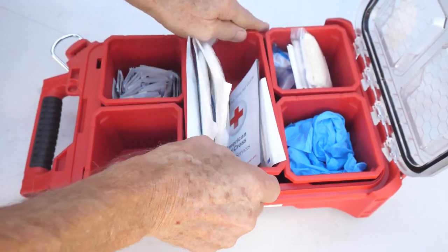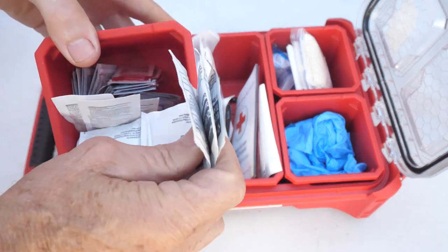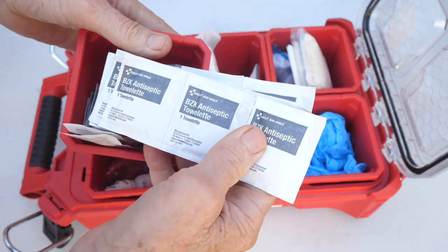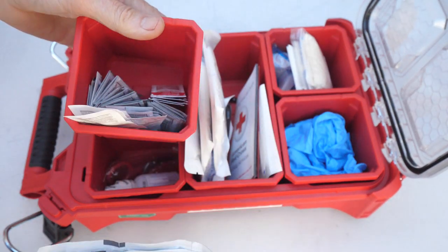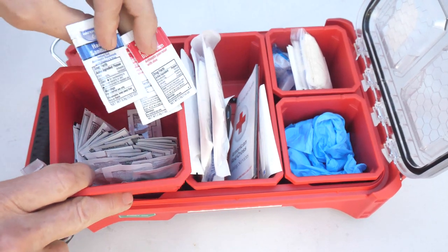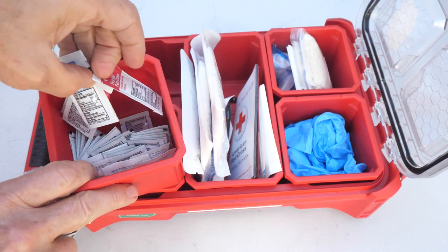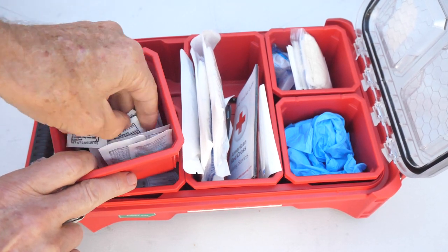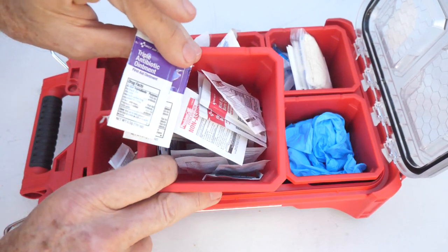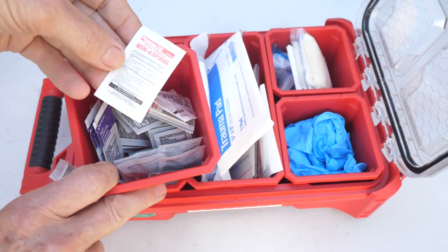Over here we have a lot of antiseptic pads — these are antiseptic towelettes. In this section you've got hand sanitizer and first aid burn cream, so you've got a whole selection of different items. There's also triple antibiotic ointment and extra-strength non-aspirin for pain relief.